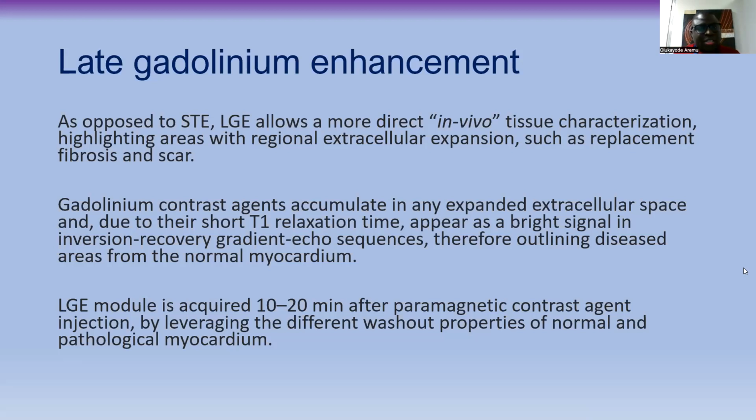Once you introduce that radio frequency, it chases the protons. It makes them dance around, if there's a word like that. I'm trying to make it a bit interesting so that you can get what I'm talking about.